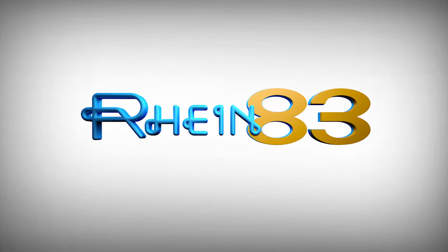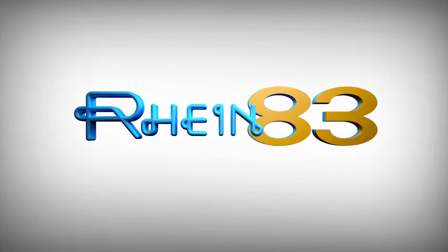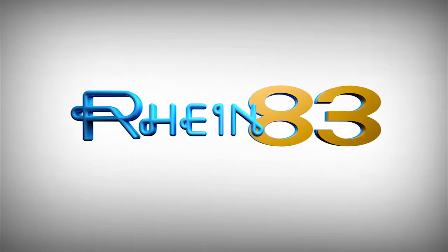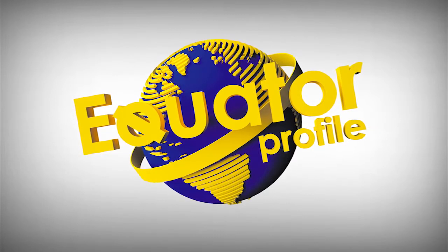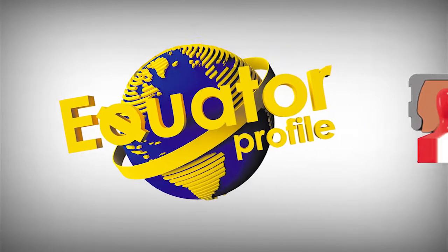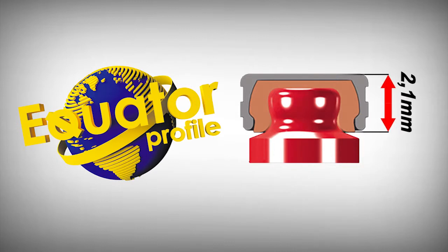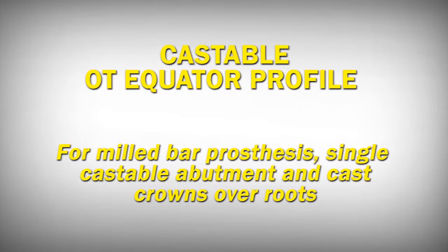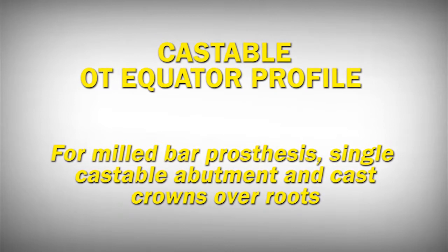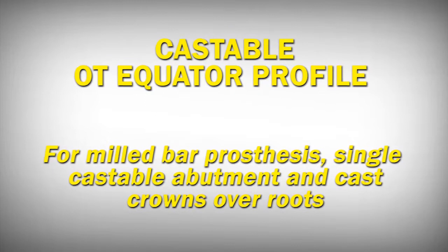From the experience gained in 30 years of using spherical attachments, Rhein 83 has developed a new spherical shape attachment with sub-equatorial retention named OT Equator Profile — the lowest profile attachment on the market. Castable OT Equator Profile single attachments are available for overdenture, milled bar prosthesis, single castable abutment, and cast crowns over roots.